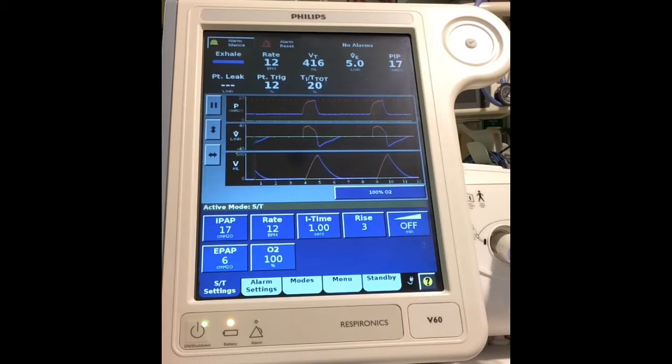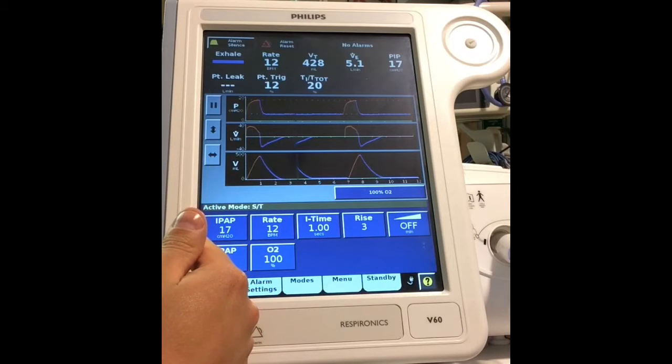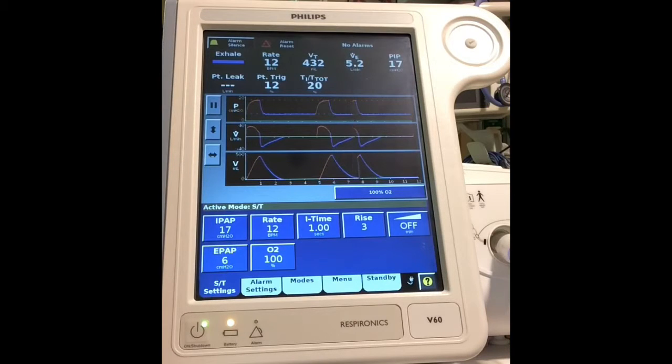I do wait a couple breaths to see if it doesn't recruit. And you can see it slowly going up. 432. I'm going to give it a minute. It may go back up. Let's talk about the next things.